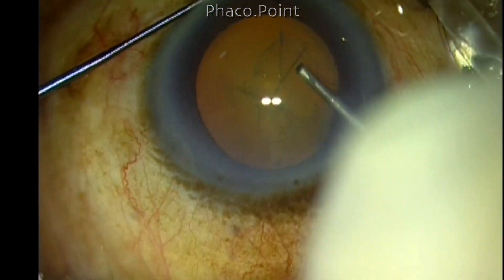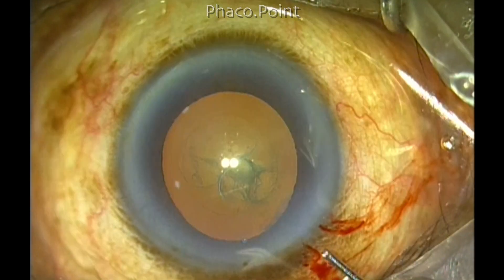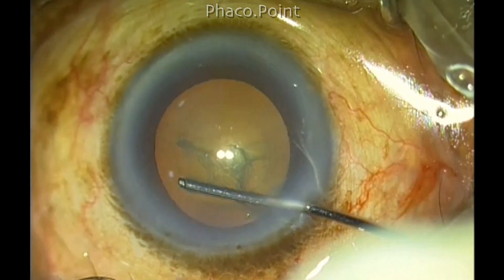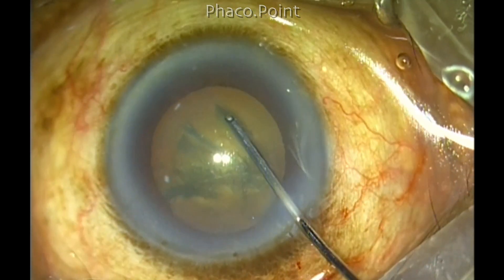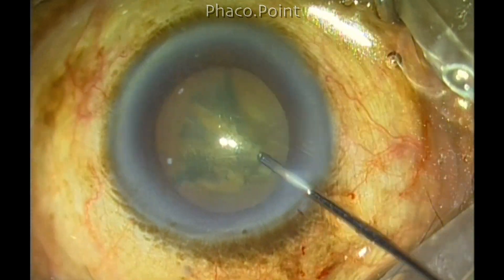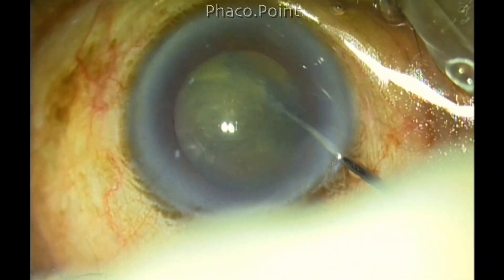I managed to get a successfully well-centered and round capsular rhexis; however, it became a little smaller than 5 millimeters — maybe just between 4.5 to 4.9 millimeters. This is also an ideal size to perform phaco. Cortical cleavage hydrodissection is done, and while doing so I detected that the central nucleus rose up but the fluid was tending to get trapped behind — therefore I gently rotated the nucleus in order to prevent a capsular block.